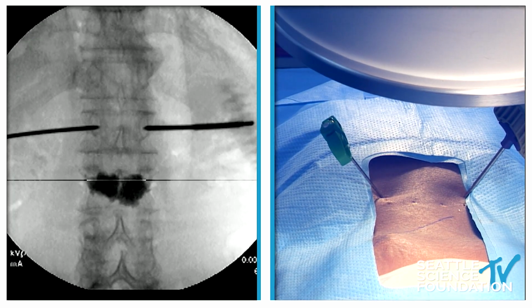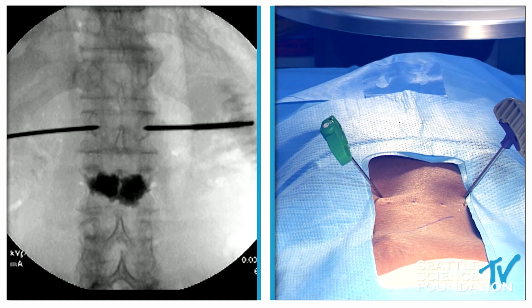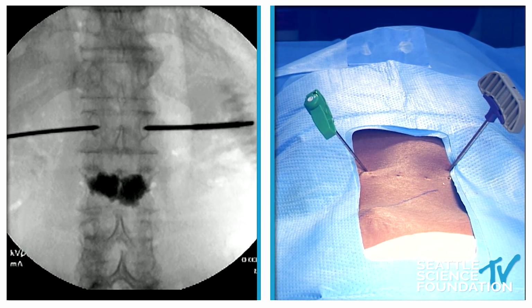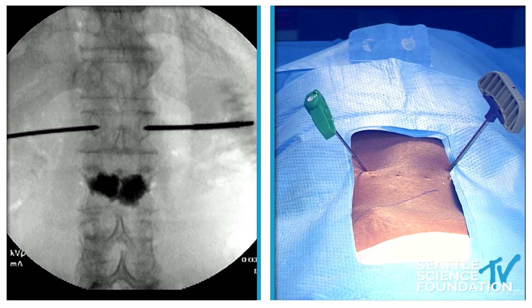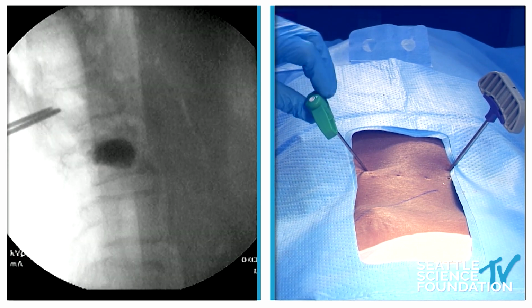So we'll take a lateral shot there, and we're starting at 9 o'clock and 3 o'clock, and we'll check our depth. And if we're in pretty good depth, we're going to drive it medially, place a K-wire, and then over the K-wire, we're going to have a rotating reamer. And I'll show you the difference between that technically and a drill. So on the lateral view, let me see which is which.